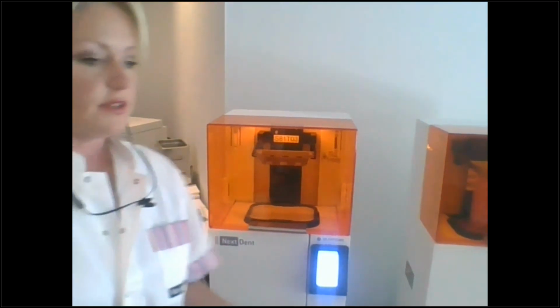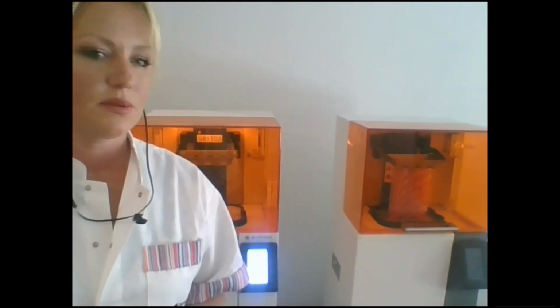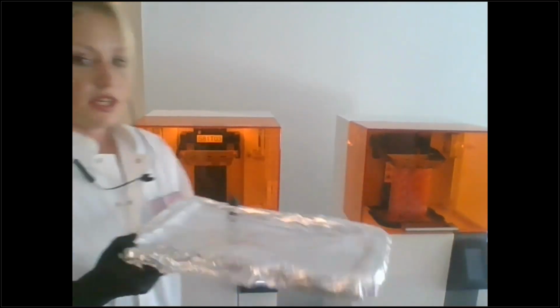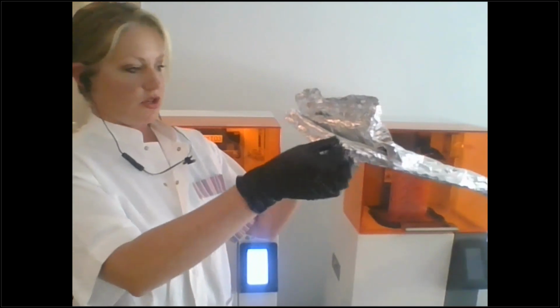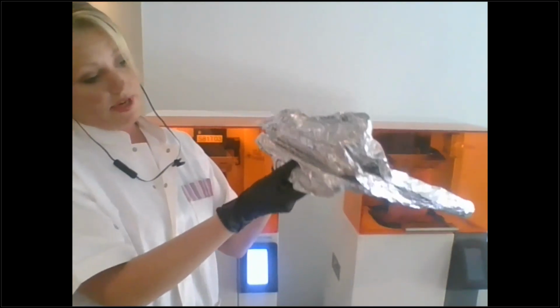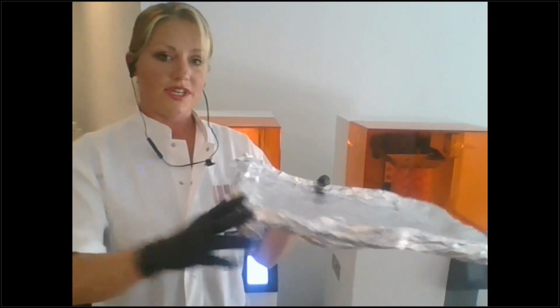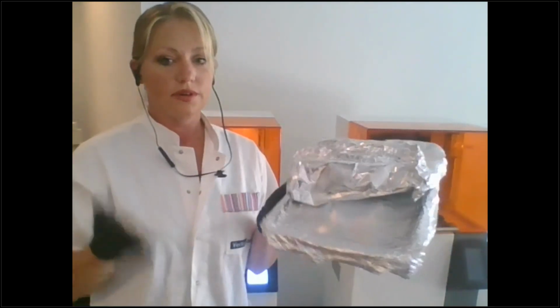Now I'm going to remove a build that's in my other printer, and this build I'm going to show you after I post-process my models, but this is kind of a sneak preview. I use a cookie sheet. It has layers of foil on it. I don't want to have to clean this cookie sheet constantly, so what I do is on Monday or Friday night, I put like 5 new layers on there or more. And then every time this gets really dirty, I can just take off a layer, throw it away, and I have a new clean sheet.